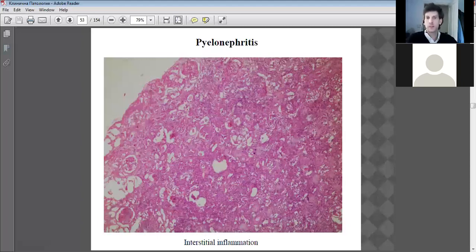As the condition progresses, more cells are dying. Lots of urea, lots of acid, lots of inflammation, because you're getting bacterial invasion as well. As the tissues die, you get lots of bacterial invasion. And some examples of necrosis there. This is sort of necrotic tissue there.